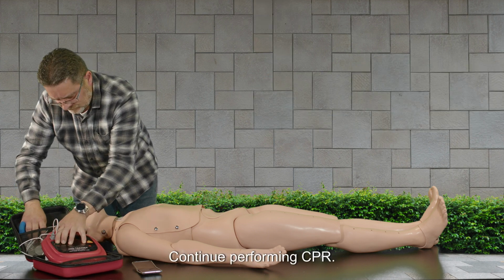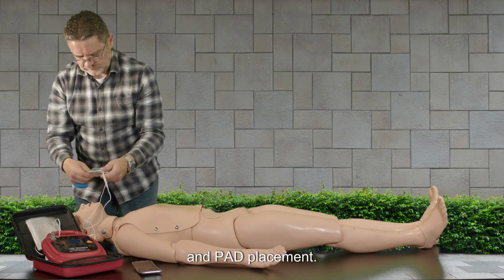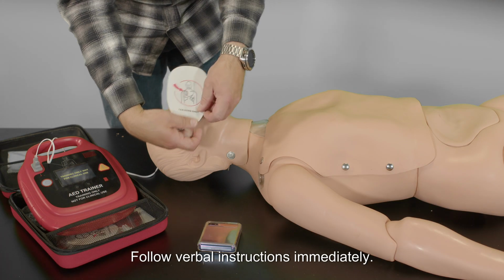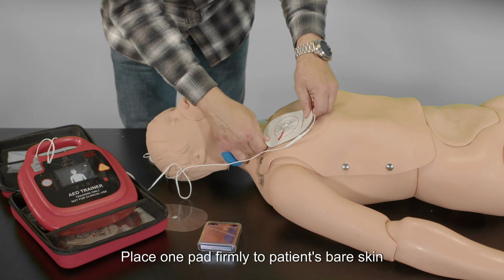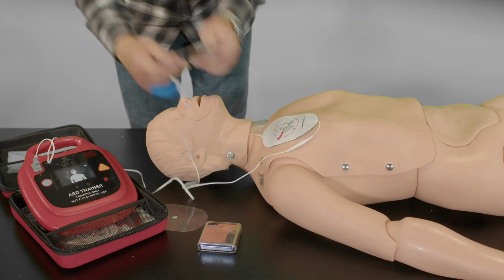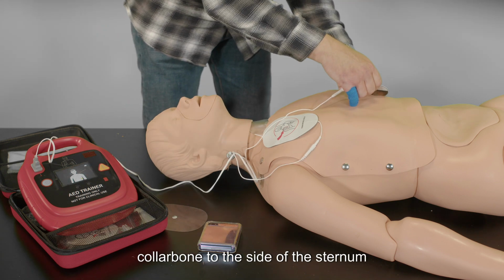Continue performing CPR. Connect the AED and place the pads. Follow verbal instructions immediately. Place one pad firmly to the patient's bare skin, below the left armpit. Place the other pad below the right collarbone, to the side of the sternum.